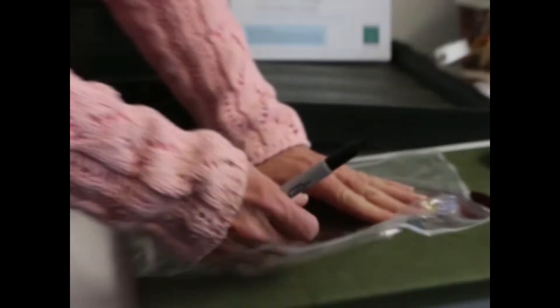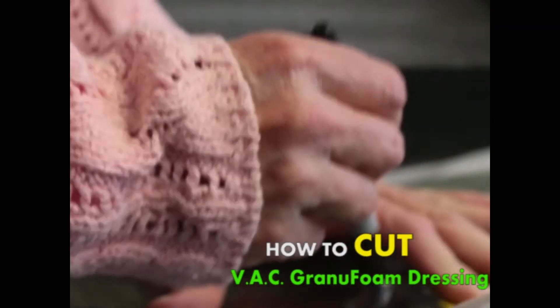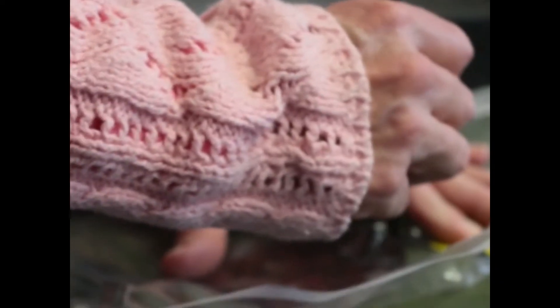So when you take it out, you remove that and you set this on top of the wound. And then you trace it because you don't want it to go beyond the wound edges, right?